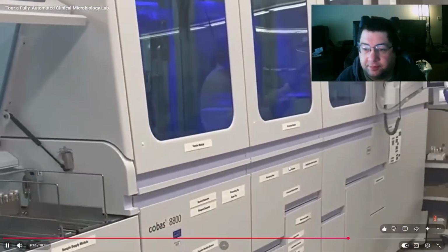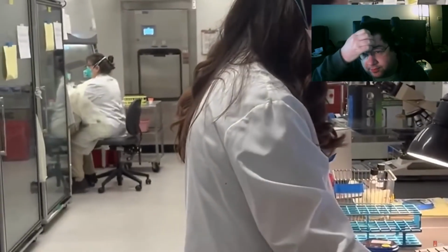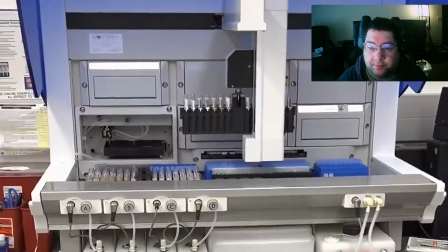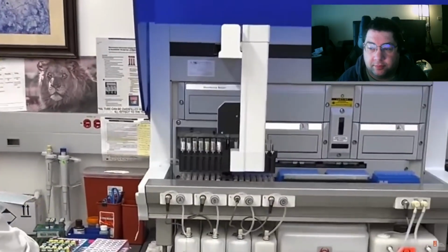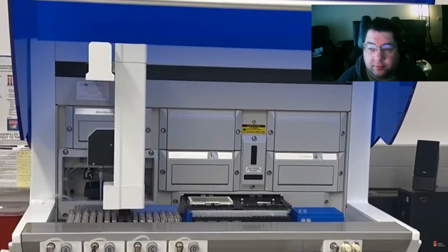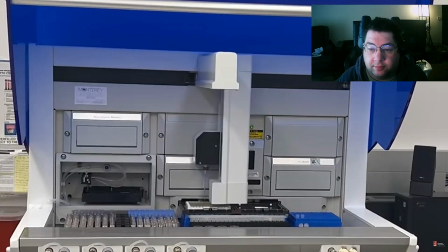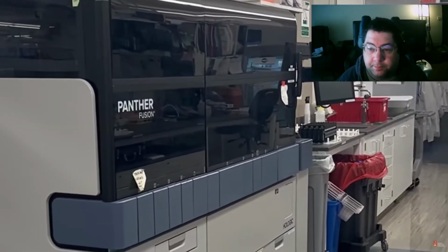To monitor the response to antiviral therapy. In mycobacteriology, we process patient samples for culture-based detection of mycobacteria, including Mycobacterium tuberculosis. A blood sample can also be used to diagnose TB infection via the QuantiFERON assay, which detects immune responses to TB-specific antigens. STI testing is performed on the Panther system.